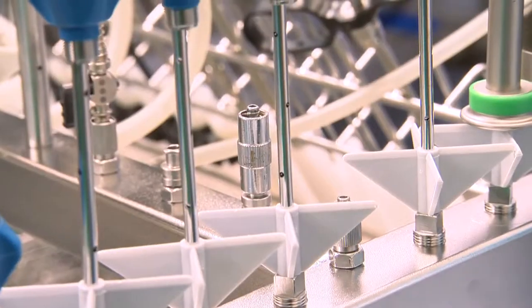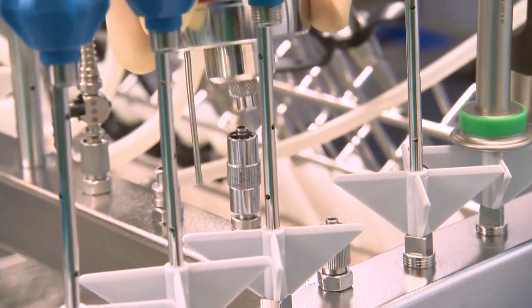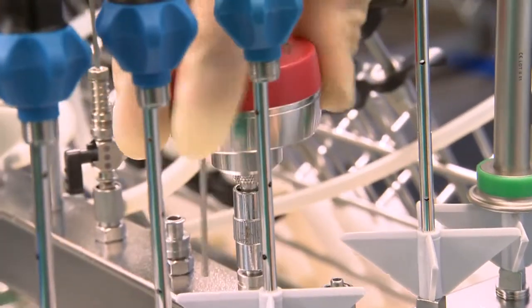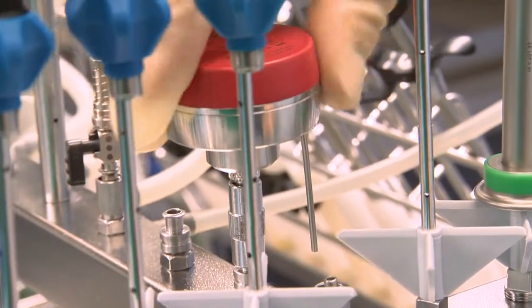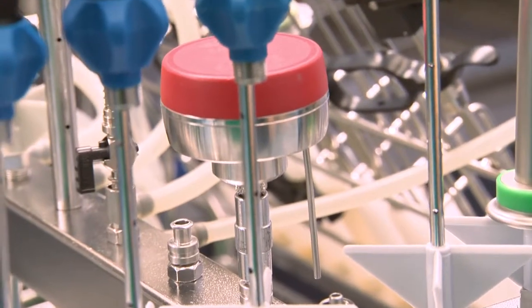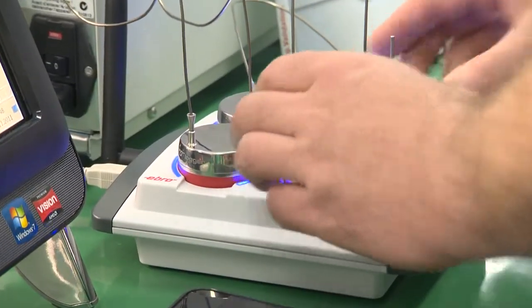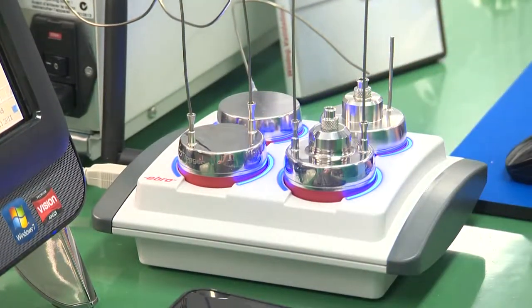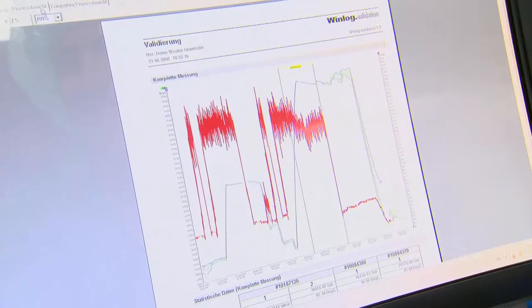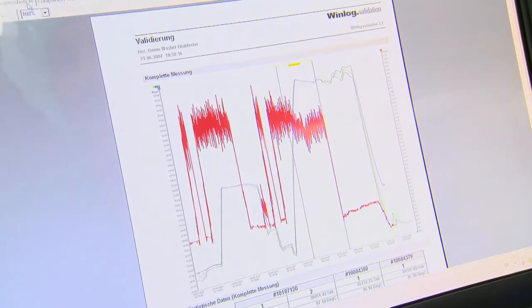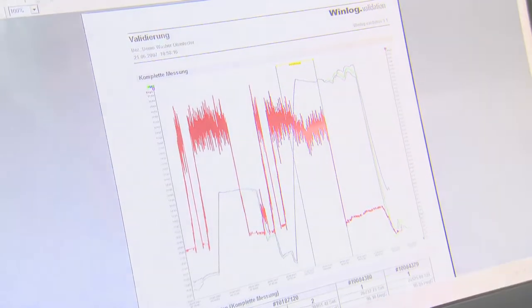The pressure logger is connected in order to determine the rinsing pressure at the lure lock connection in the washer disinfector. Once the data logger has been read out, the software prepares the validation report fully automatically.